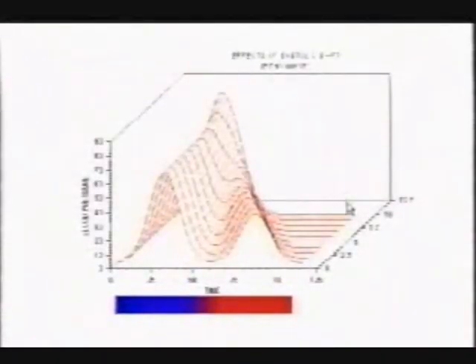This is a three-dimensional view of equal increases in systolic shifts. Notice how little effect early shifts have on coronary blood flow or blood pressure. On the other hand, with each further increase in systolic shift, the changes do not just increase linearly, but appear to multiply and compound rapidly in terms of coronary flow decrease and increase in blood pressure.